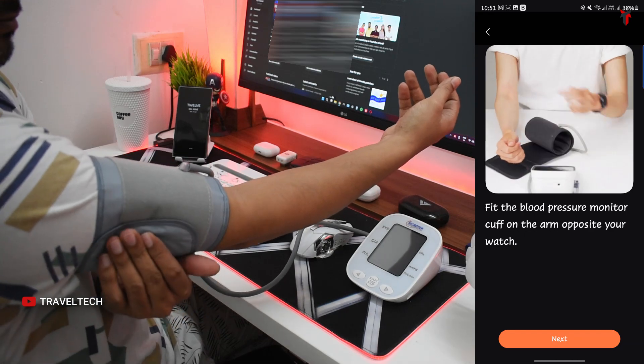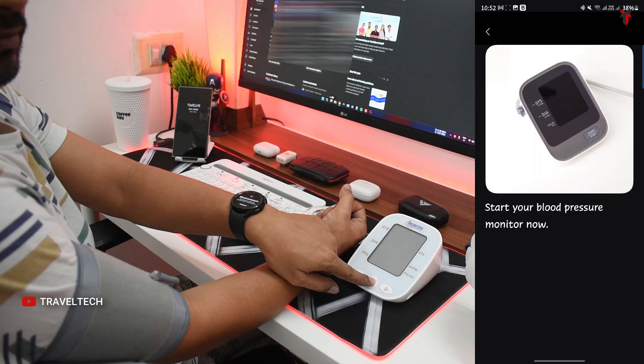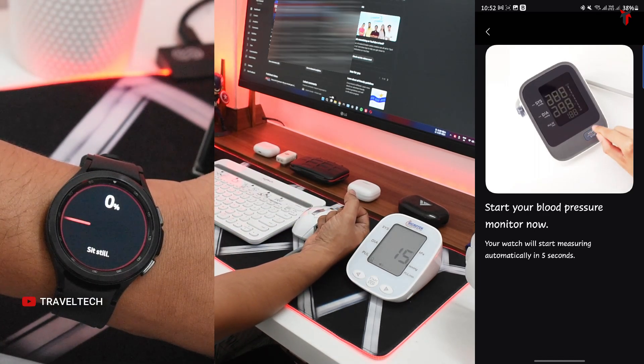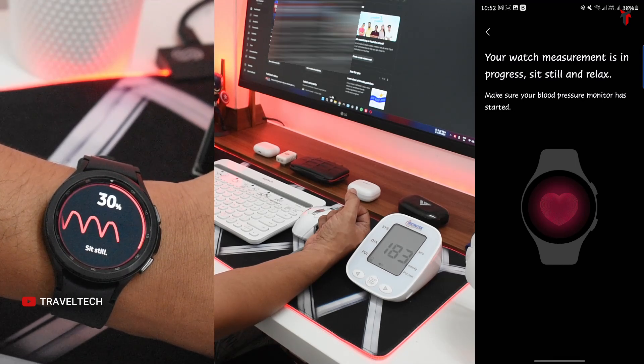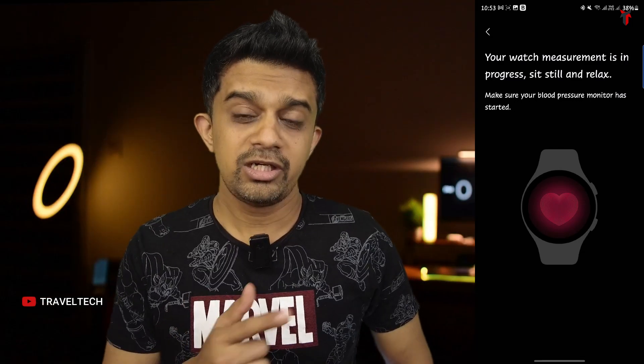Once you've followed all these steps, start the blood pressure monitor and wait for it to make a measurement. The smartwatch also begins measuring your blood pressure at the same time you start the monitor. It tracks your heart rate and BP simultaneously, and once the monitor gives a reading, the smartwatch also stops measuring and asks you to enter the blood pressure shown on the display into the app.